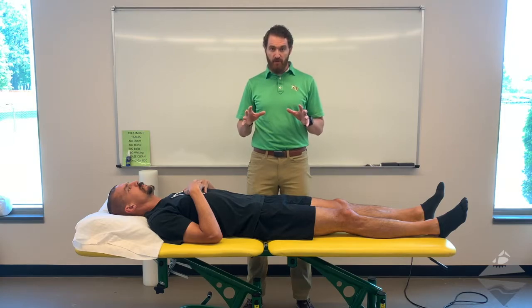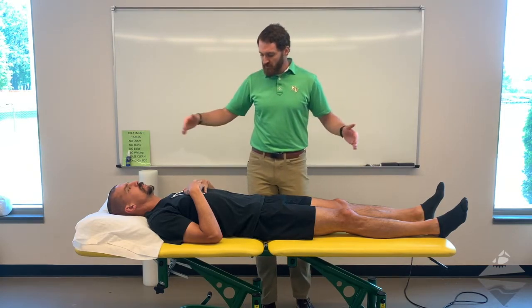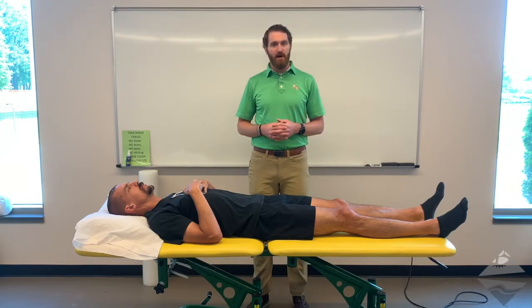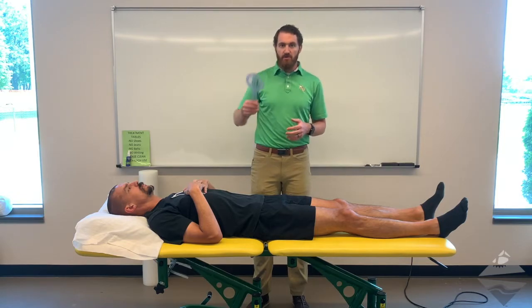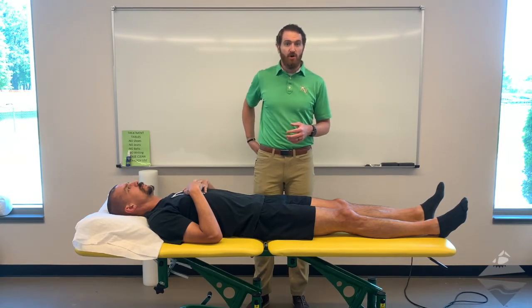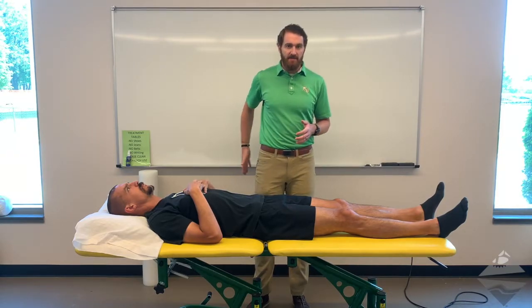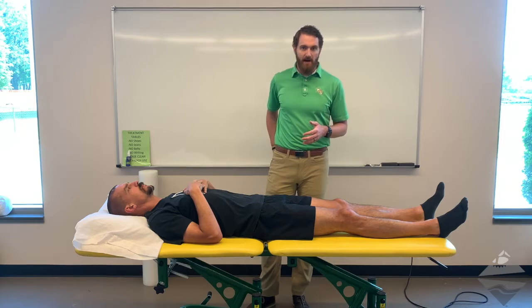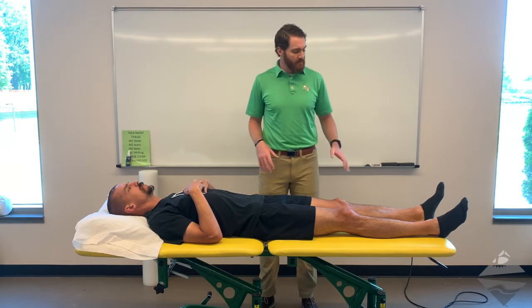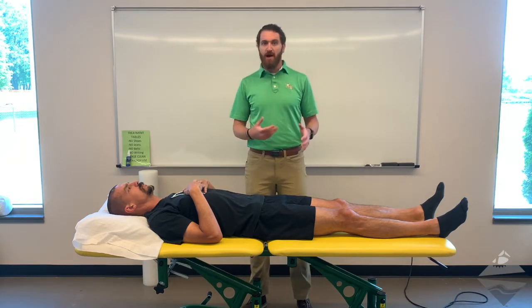We're going to presume you've completed those steps and dive straight in. The first thing you need to do is get your patient into a supine position. You need to have a goniometer handy and know what motions you want to formally assess. It's helpful to keep the goniometer in your back pocket, or you can set it on the treatment table and grab it as needed.